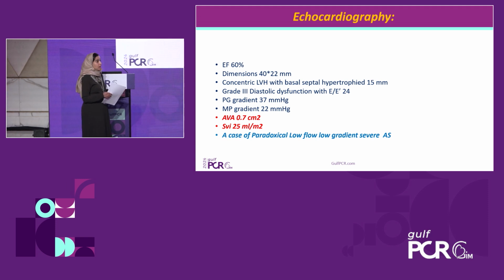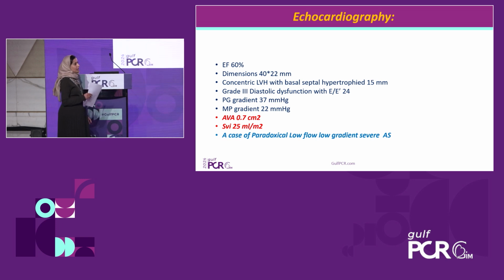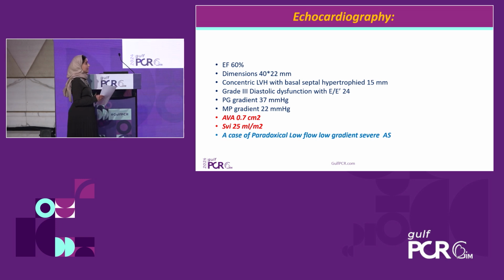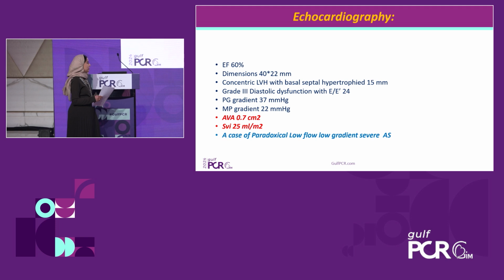First of all, ejection fraction, which was okay in this case. Yes. The stroke volume index, though, is low. Dobutamine stress echo in these cases is not the best, because we know that the EF is actually normal. So we typically tend to rely on the CT scan, knowing though that the calcium score in our region is not as high as what we were seeing outside. So we're relying on numbers that are extrapolated from a different population, but we still go by those numbers.